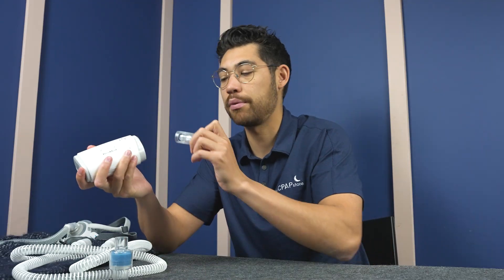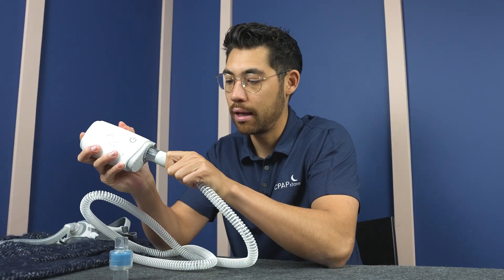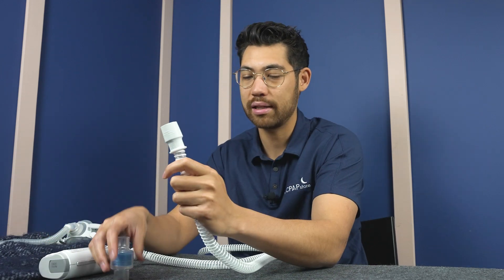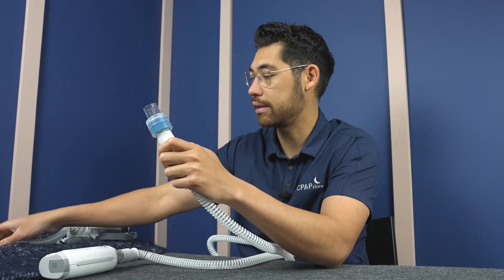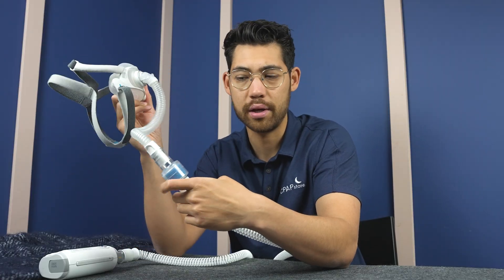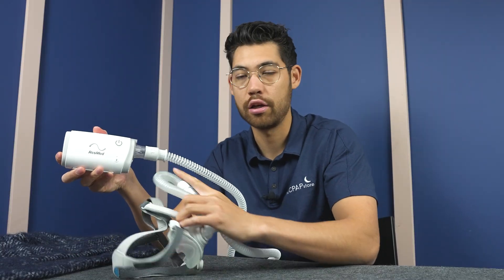First things first, if you have an Air Mini, you're going to take your Air Mini adapter like this. If you don't have an Air Mini and are using another travel CPAP machine like a Transcend Micro, then you can skip this step. For this example, we're going to use the Air Mini — I'm going to take the adapter and put it in there just like that. Now I can use any generic tube, so I'm going to take this generic, unheated CPAP tube and put it on there. At that point, we can take the end of this, take our HME, and put that together just like so. Then we take our mask — here we have an F40 — and put it in just like that. Now we have the mask of our choice connected to an HME, connected to a generic tube, connected to the Air Mini using the adapter.